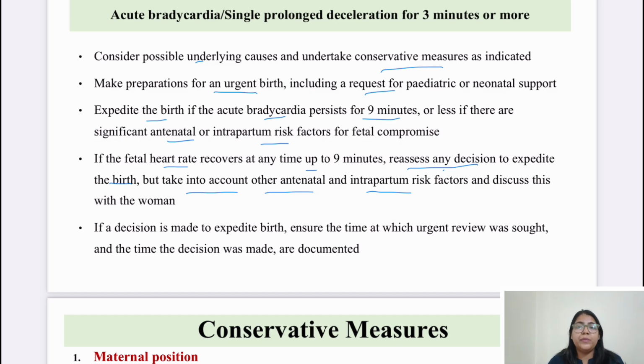Always inform the patient what is happening and what you are going to do, how you are going to manage the condition. If a decision is made to expedite the birth, the time at which urgent review was sought and the time that the decision was made has to be documented. Okay, so all these are medico-legal. You cannot wait for half an hour in case of acute fetal bradycardia.